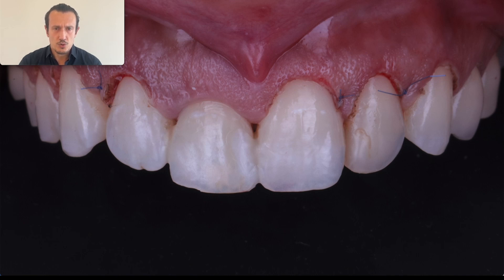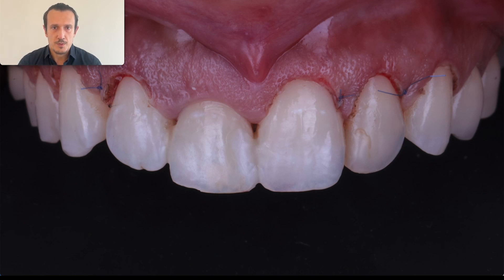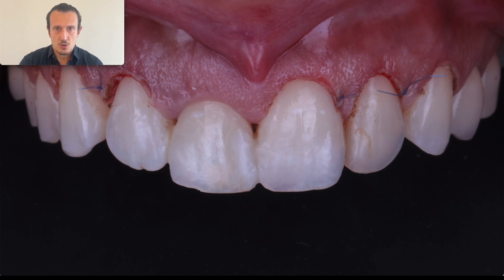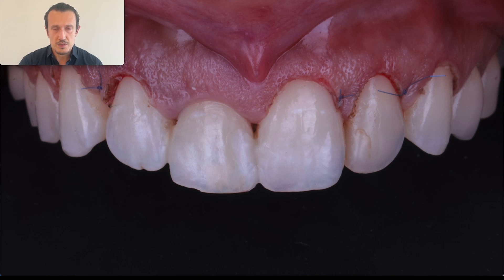This is the situation immediately after the surgery. In this case I put one small suture on every papilla just to have a more stable situation — normally during flapless crown lengthening you don't need sutures, but in this case the papillas are moving a little too much, so I applied additional suturing. You can see that the soft tissue is in excess on the implant side, which is why we don't need to use an additional connective tissue graft — this is a very rare case where we are not using a CTG when performing immediate implant placement.